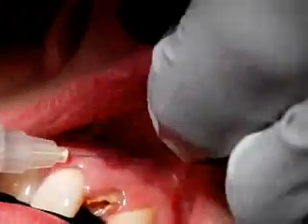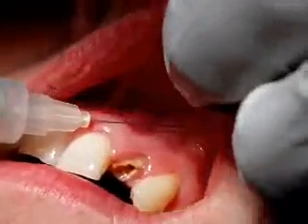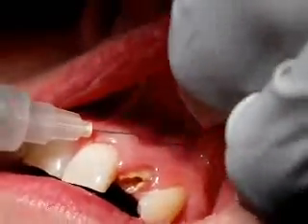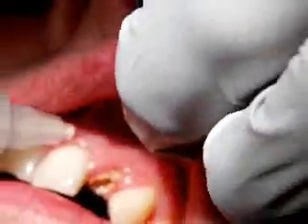Just wiggling the lip around a little bit, popping the LA in very, very slowly. Sing to your patient, or chat to your patient, or whatever it is you're going to do.